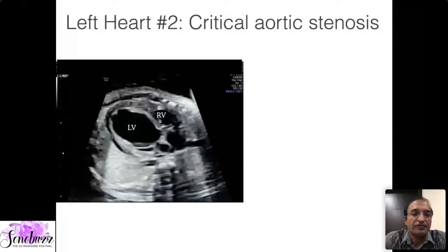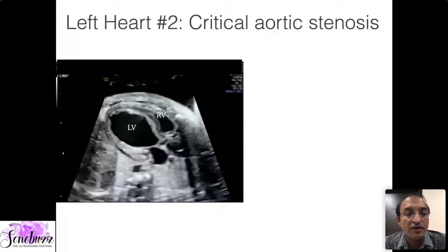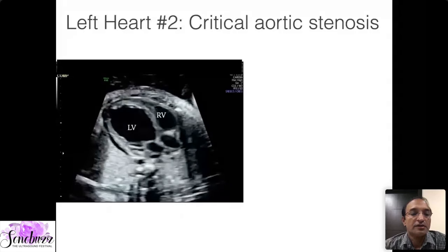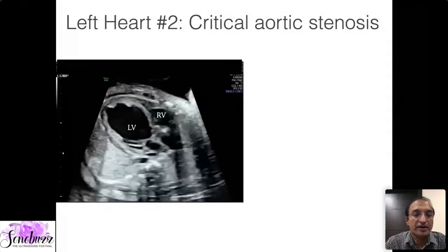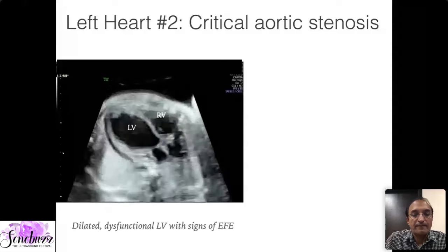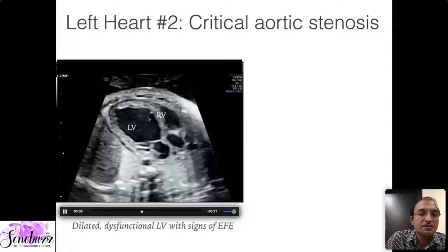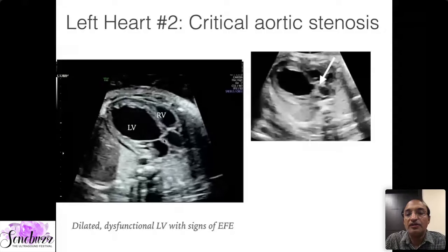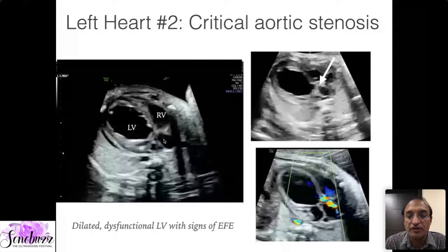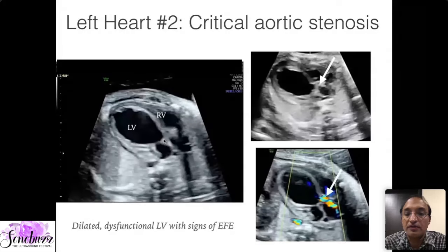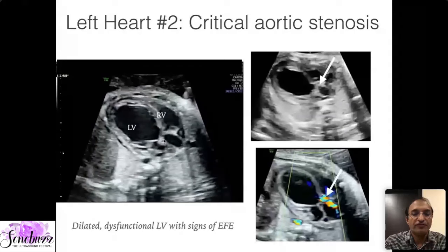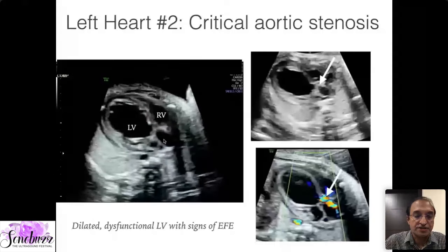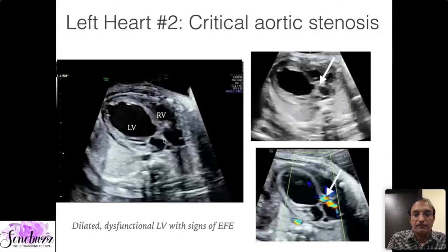Now for aortic stenosis — the left and right ventricles are marked, and in this movie you can see that the left ventricle is quite severely dilated, hardly moving, while the right ventricle contracts well. There are bright patches on the ventricular septum suggesting endocardial fibroelastosis. Looking at the left ventricular outflow tract, there is severe stenosis of the aortic valve with some antegrade flow but the valve is severely stenotic. Some centers perform in-utero intervention with aortic valve dilatation, but that is a very major procedure to be discussed separately.